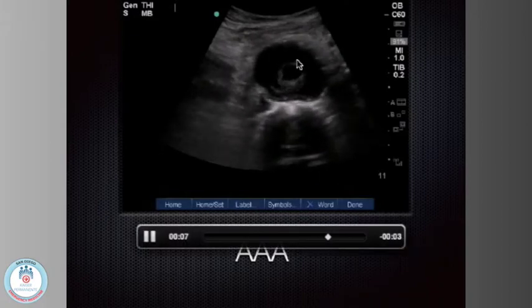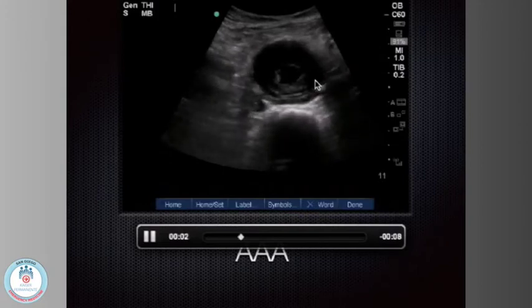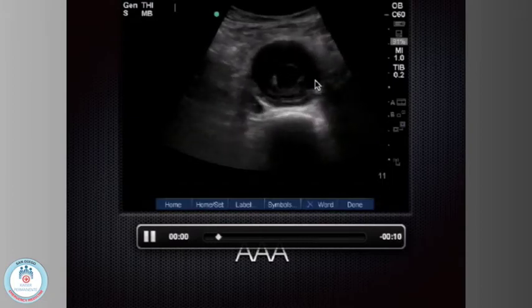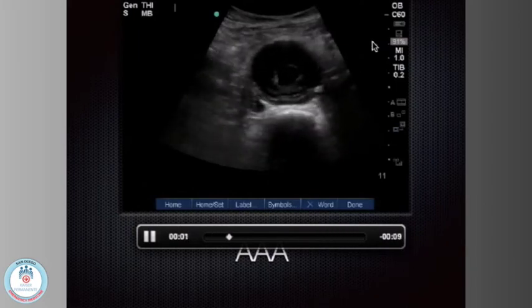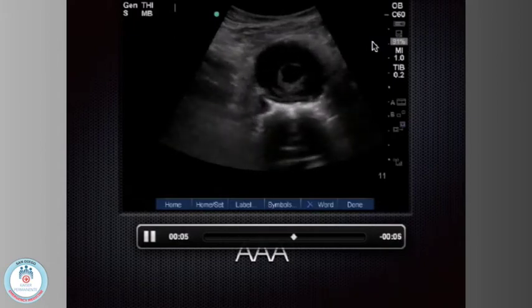And you can see these things are the reason why Virchow and all those William Oslers that came before us would say the AAA is the great mimicker and will trick you, and they have all these clever quotes throughout medical history, because of all that mural thrombus. Do you see all this? This is all clot. Here's the lumen here. The actual AAA is like from the spine all the way up here, but it's dampened. The pulsatility is dampened by all that clot. That's why you can't detect these on the physical examination.